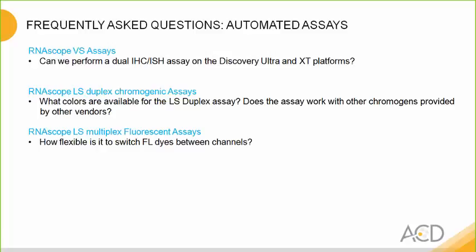For the LS multiplex fluorescent assays, you might wonder how flexible is it to switch fluorescent dyes, and it's actually quite flexible in the sense that you are preparing the TSA plus the fluorescent dye, and you may change it accordingly to which fluorophore you'd like to see for which channel of probe. Again, if you have more specific questions, you can contact ACD technical support.